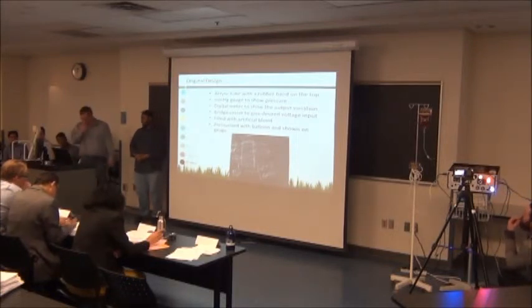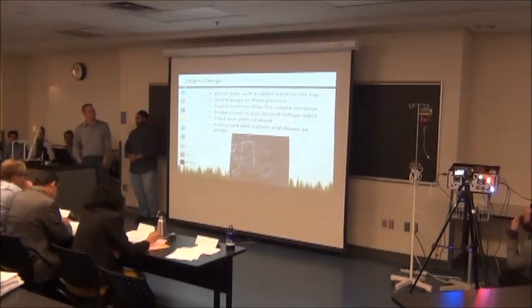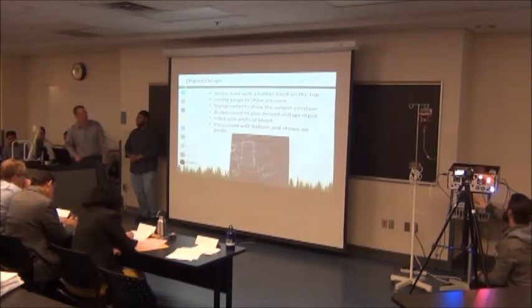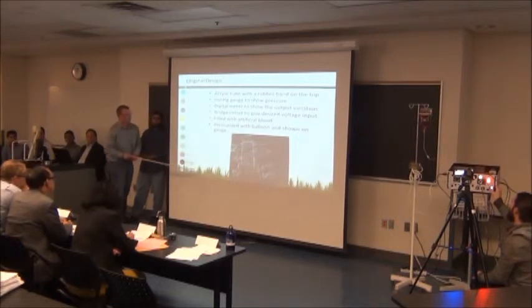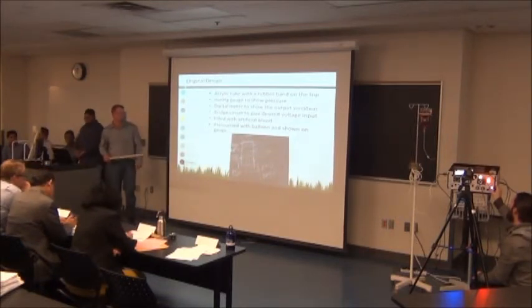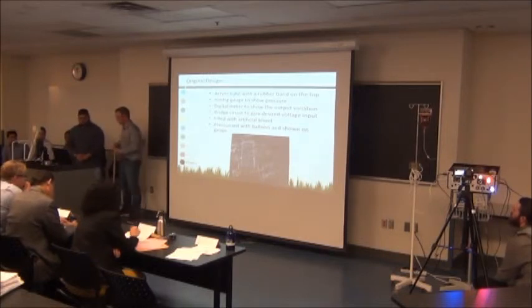As Jeff showed before, there's the transducer slide with the picture underneath. What we originally designed was to use an acrylic tube filled with artificial blood and using a syringe to pressurize it, with a diaphragm on the top. The transducer would then be mounted in the fluid as well to read any pressure readings. But that was not our final design, and I think we'll pass on to Faray to show the final design.